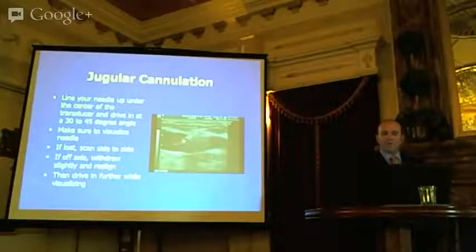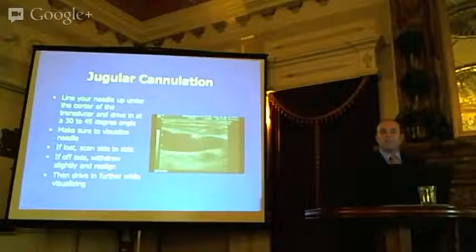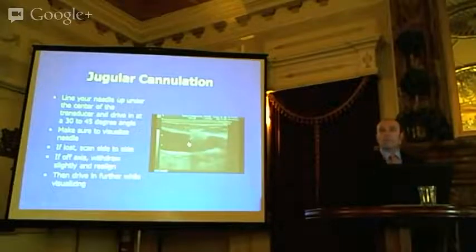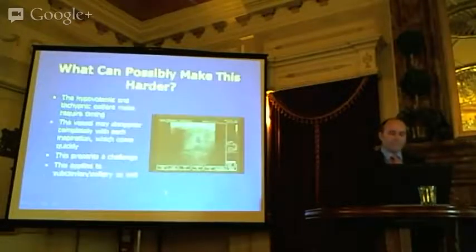look how tough that vein is. Look at that wall. It's just tenting completely. This is a reality people forget about veins. And this is why it's really nice to have that long axis view. In short axis, you can actually think you're in the vein by that point, because remember that needle? It was in the middle of the IJ. In short axis, that should look like it's incomplete. But you know, why does your wire not feed? Or if your wire fed, why does your line not feed? You can't see that unless you're seeing it.